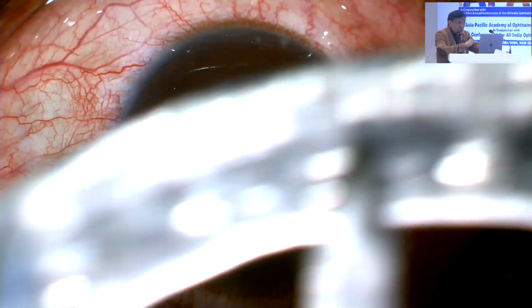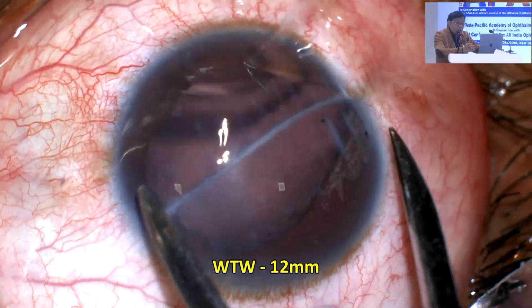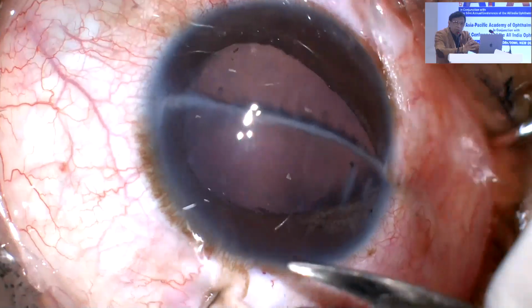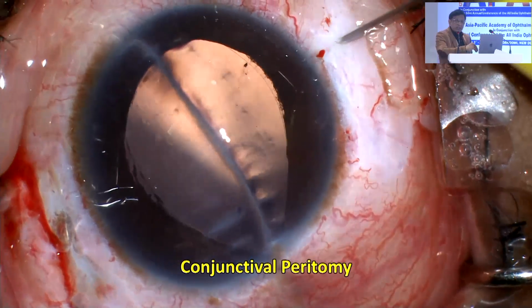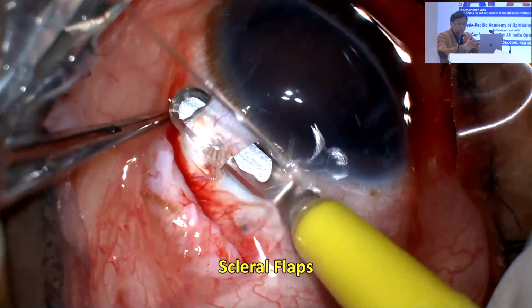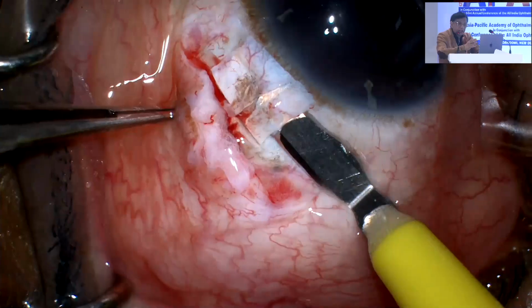Now, the patient has a scar right in the center. The question comes, now how do you manage it? There's no capsule worth the name obviously there. Normally, we'll say go for a penetrating keratoplasty. And what we have started doing is cases like these, where you have scars, where you have even opacities, and I'm showing central scarring, which peripheral is easy. I'm trying to avoid a penetrating keratoplasty.